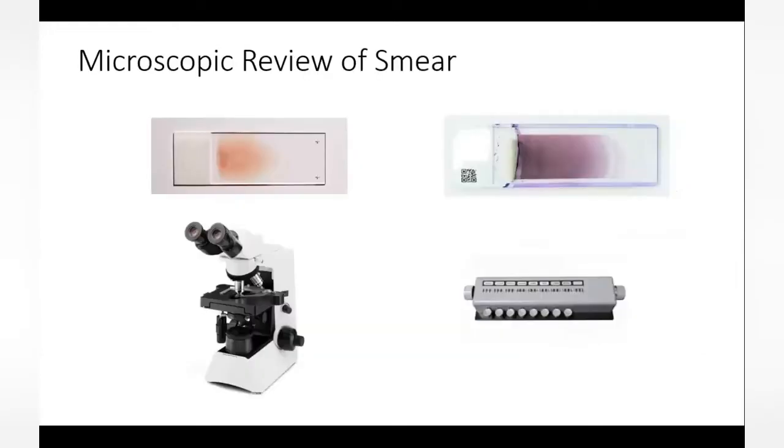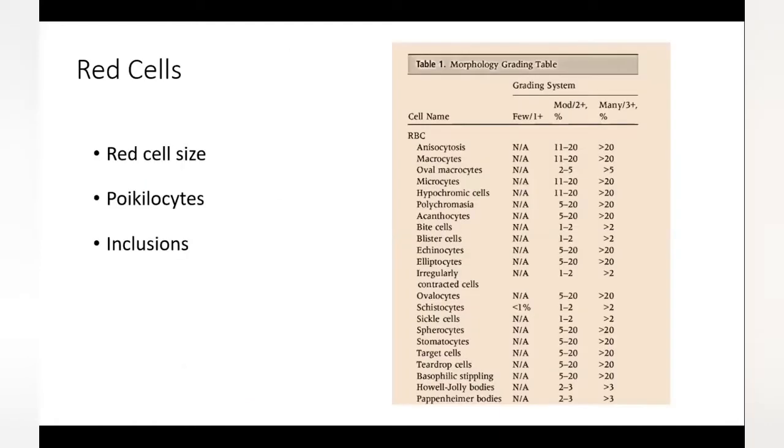And so these are the various touch points that go into a smear review. And what I'm trying to emphasize here is, okay, we'll finish RBCs and come to that. So when we're looking at RBCs, we're trying to analyze the RBC size, shape, and inclusions. By and large, that is how we're trying to categorize.